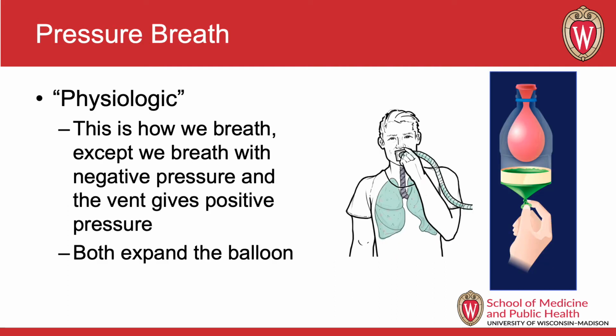Now, pressure breathing is how we would describe as physiologic. While I talk, I want you to take some deep breaths through your nose and notice that you are pulling negative pressure from your diaphragm, and you're getting air in through your nose, and that air comes in really quick at the start of your breath, and as your lungs fill with air, that negative pleural pressure is not enough to keep inflating the lungs at the same rate, and the air flow over your nose goes down over time.